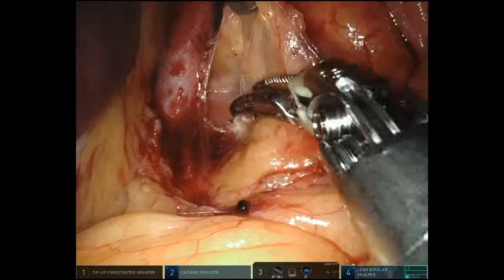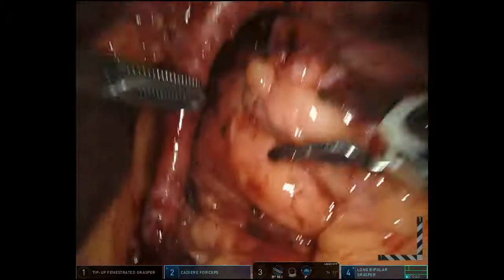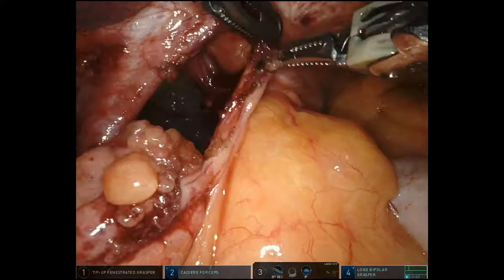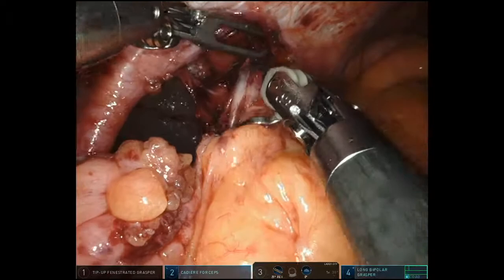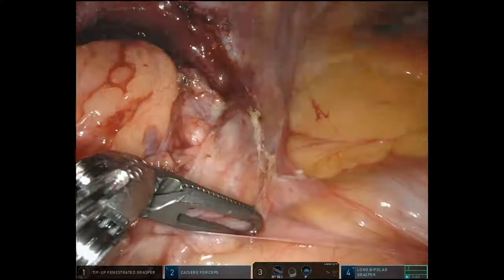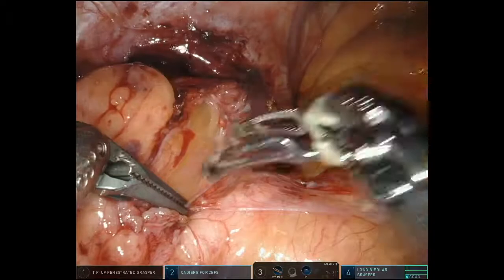You're starting to see where the right and left crus come together posteriorly — there's the left crus and the right crus of the diaphragm. Seeing that landmark is a key part of the case. I'm going to start dissecting out the left crus using bipolar cautery, with my table-side assistant pulling the stomach down and to the left and my fourth arm pulling everything to the right. I'm dissecting that space between the gastroesophageal junction — the angle of His area — and the left crus of the diaphragm. This hernia has probably been there a long time, so it's a little tricky to find that space, but we're starting to get into it.